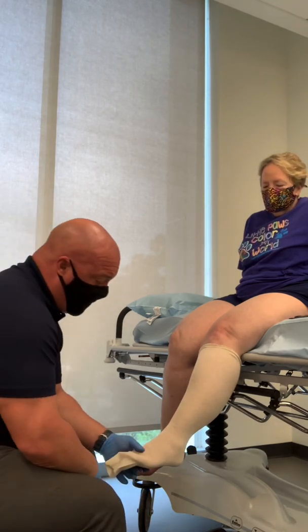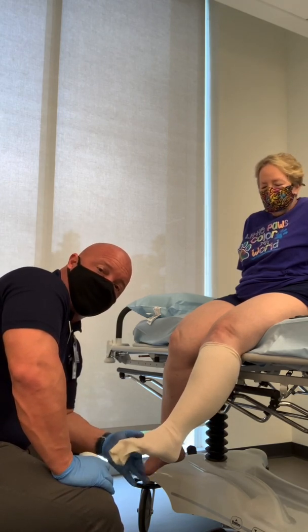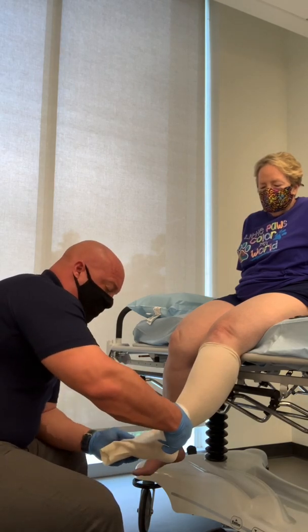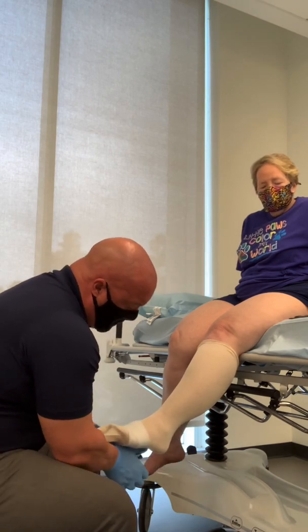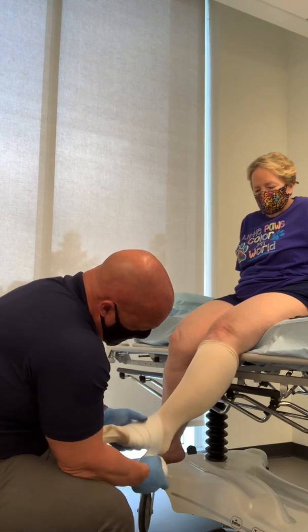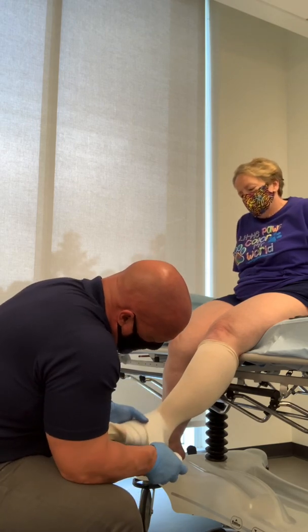We're going to start right at the base of the toes — the base of the great toe, the MP joint — as your marker, you're going to place your cast padding there. Then you're going to work up, distal to proximal, overlapping about half to one-third of the cast tape diameter.